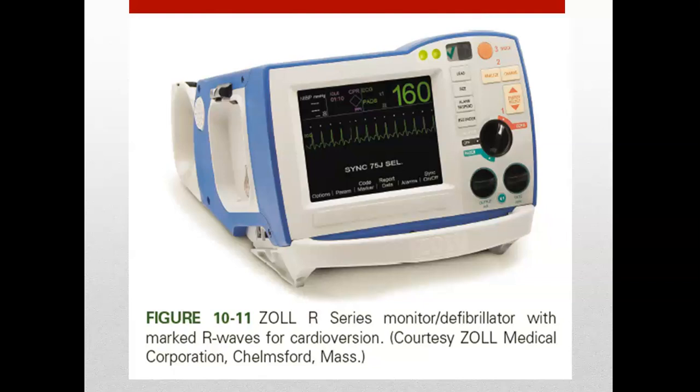The patient has to be connected directly to the defibrillator to monitor for synchronized cardioversion so that the defibrillator can detect and mark that QRS complex. And then that allows for the electrical current to be delivered during the QRS, avoiding the T wave, which, remember, is the vulnerable portion of that cardiac cycle.